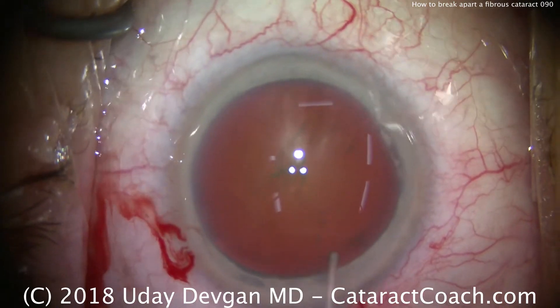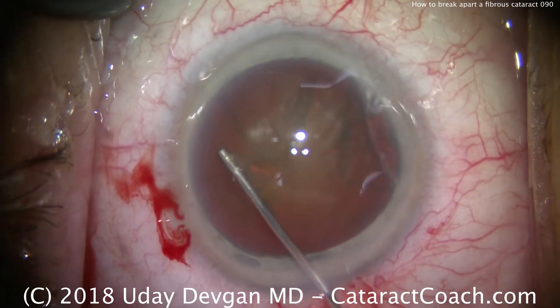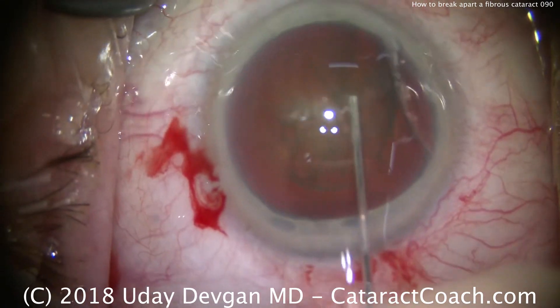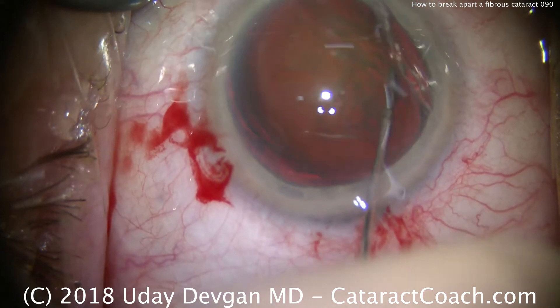Hydrodissection is going to be carried out here. There's a fluid wave coming across. Tap the nucleus, another fluid wave. We certainly want this lens to be mobile — you want it to spin in the capsular bag in order to facilitate removal. And there it does spin.